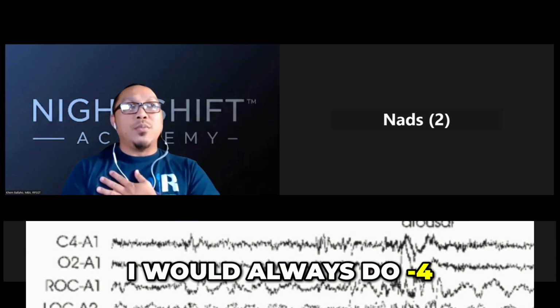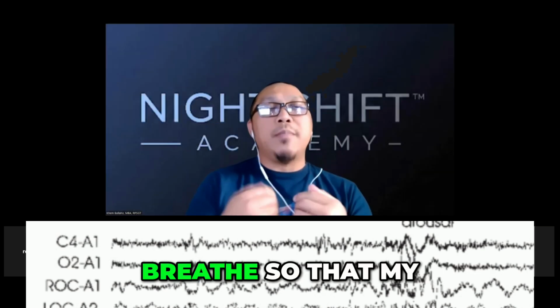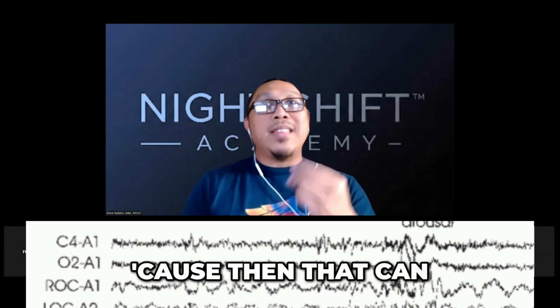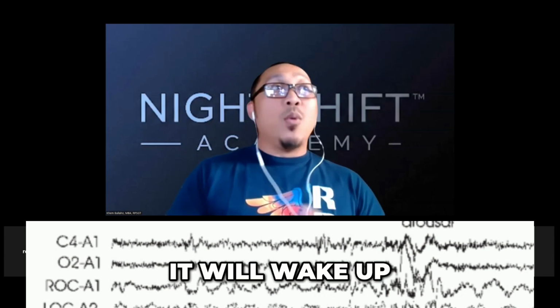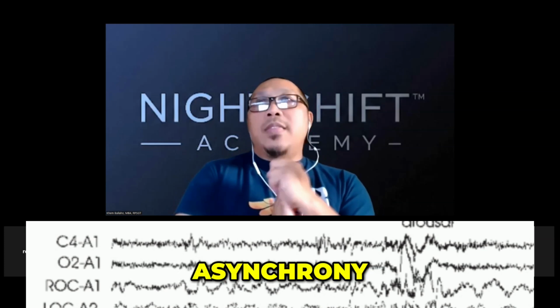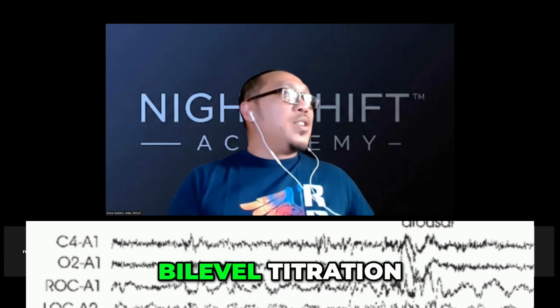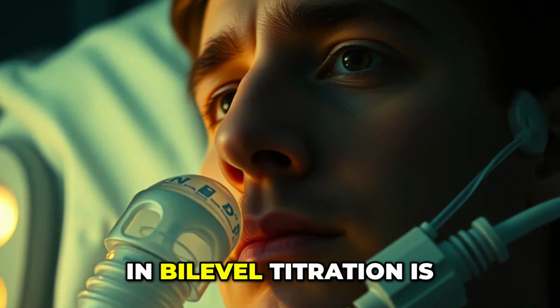I would always do -4 just to give the patient more opportunity to breathe so that my backup rate is not going to be aggressive, because then that can cause the patient what? If your backup rate is aggressive, what happens? It will wake up your patient because you will cause asynchrony. This is one of the major lessons when it comes to any bilevel titration. The biggest issue in bilevel titration is asynchrony.